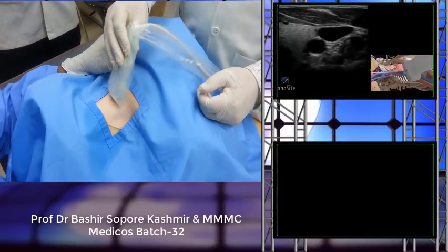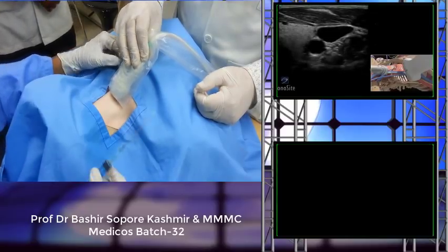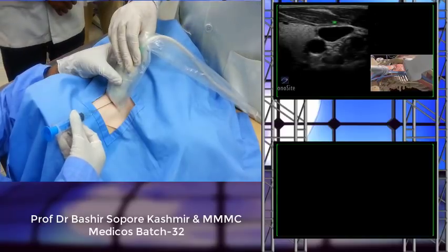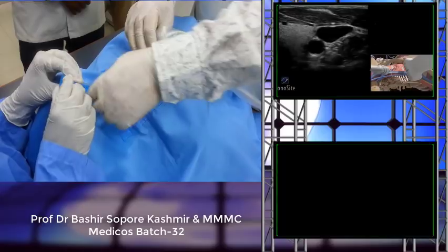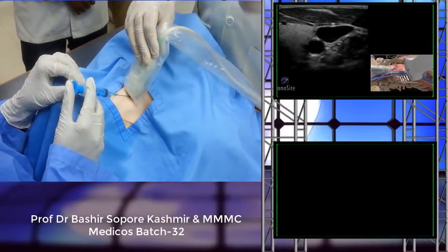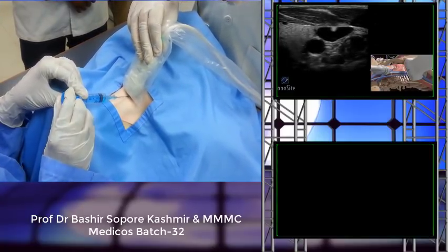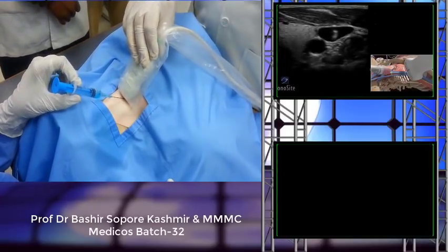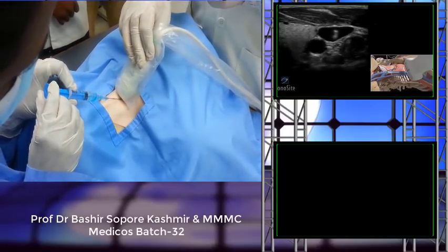Okay. Now this is the short axis. You got my point. Now you introduce the needle. So on the screen you will see where the needle is going. It goes towards the ipsilateral nipple. So when you introduce the needle, it will show that it is going into the vein by using the ultrasound probe. And this is 100% success. That is why we choose this vein, the jugular vein, for central venous catheterization.